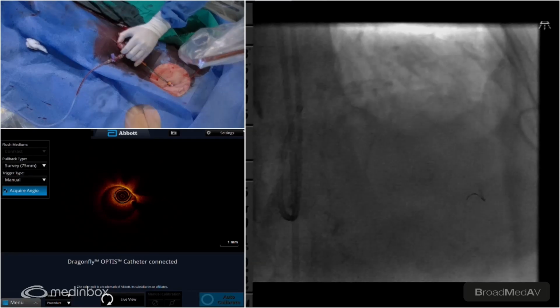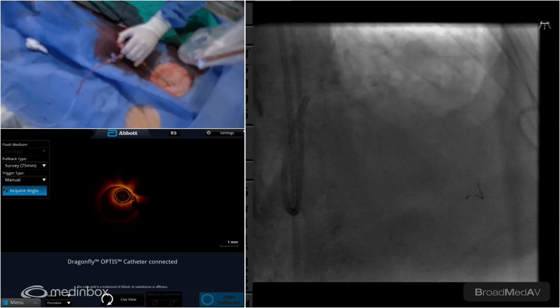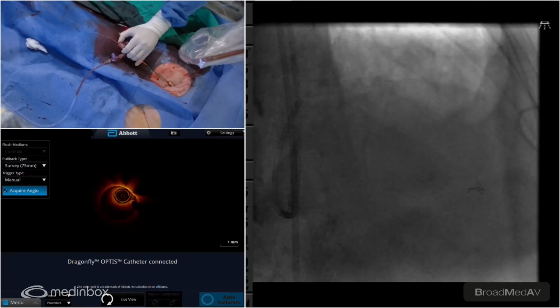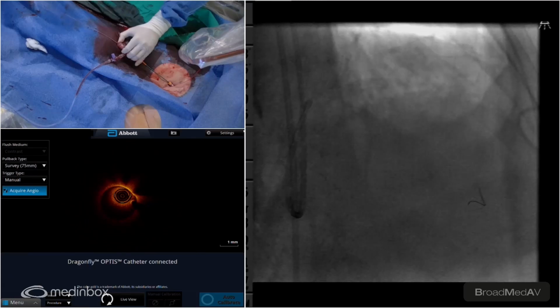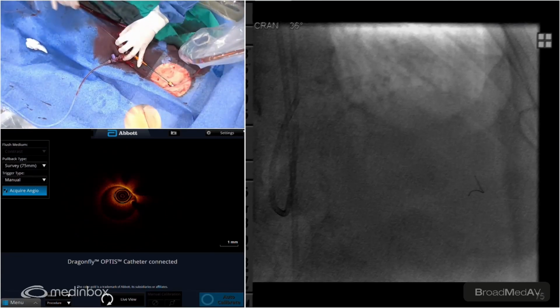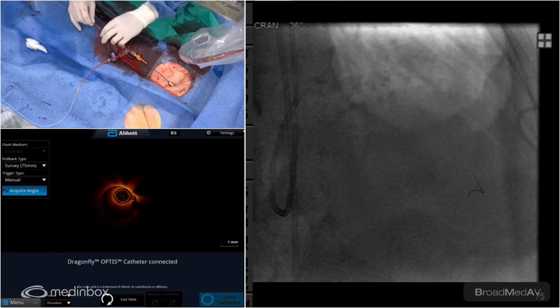So we're coming out with a 1.5 burr. That's in pretty okay. We'll do a little test shot. The burr's going to pop out soon. Perfect. I got it. Sometimes if we're happy with the burr here, usually I leave the rotor there. Go with another wire. We'll just shut this down for now.